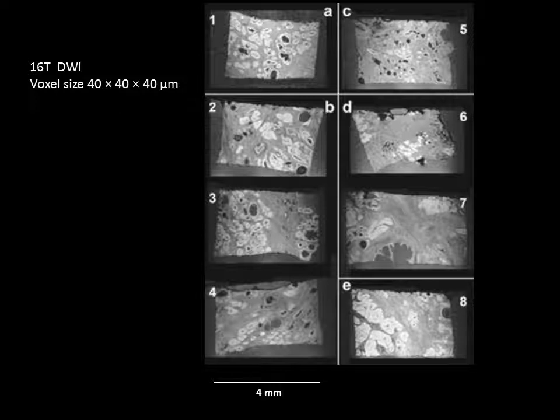The significant thing to note here is that if we look at the gland structure, we have low diffusivity in the epithelial cells lining the gland acini. We have intermediate diffusivity in the fibromuscular stroma and quite high diffusivity in the lumen of the glands and ducts.